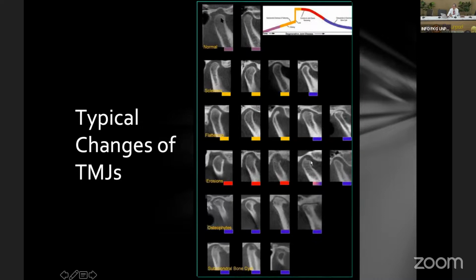This is a normal condyle with a thin corticated border along the condyle. You can see a little bit of sclerotic change in the superior aspect of the condyle, sclerosis of the condyle. You can see the flattening of the condyle, and the flattening can be superior, inferior, and you also can see flattening anteriorly and posteriorly. So you can see that on the cone beam.